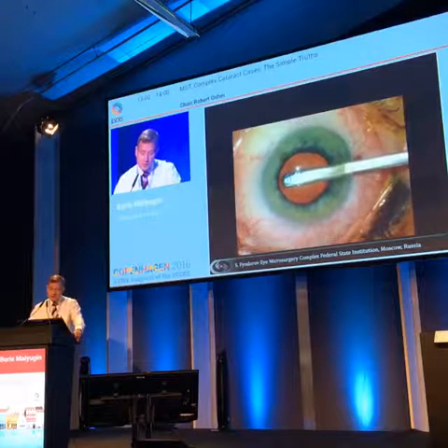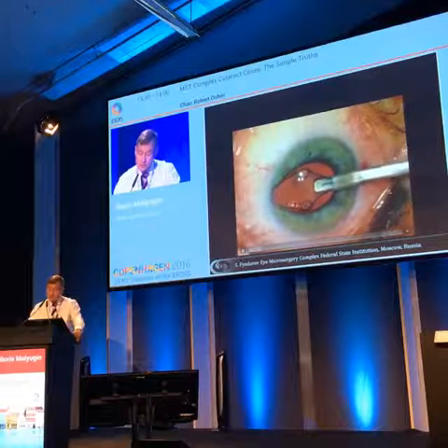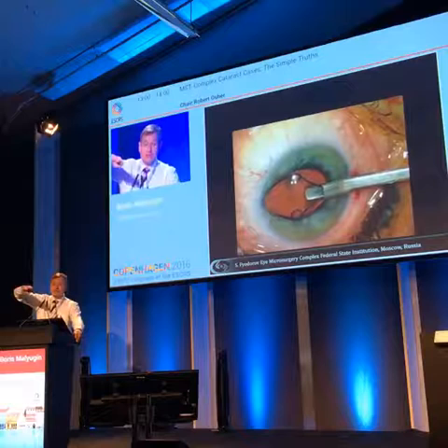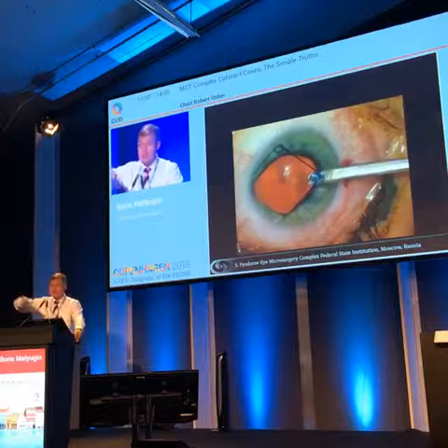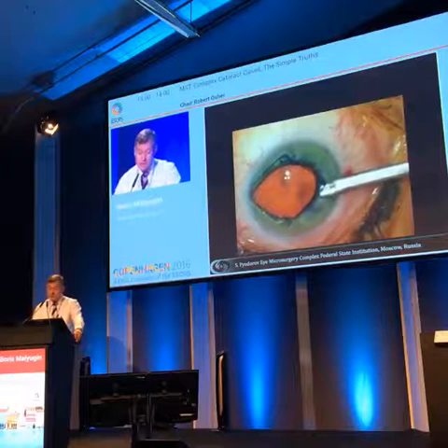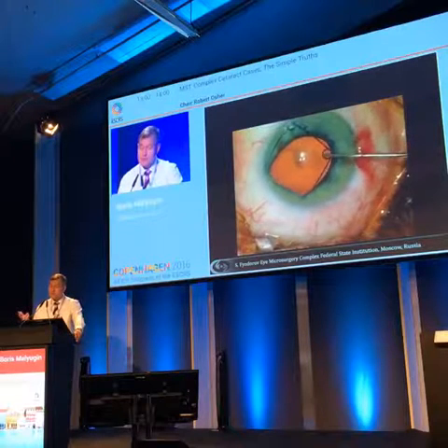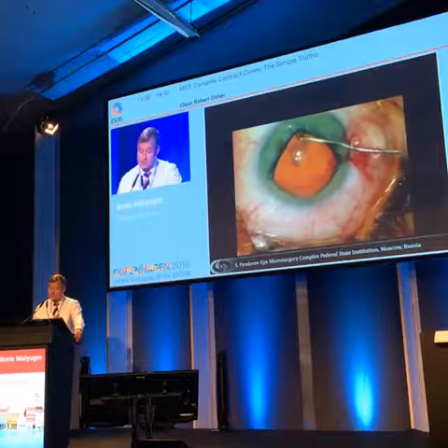I like to position the tip of the injector very close to the iris, because it helps me to control when I'm engaging the iris. And there is no shame in not being able to engage both lateral scrolls, because you can actually tilt the device a little bit, tilt the injector, in order to place it in a more proper position. This is a 7mm ring, because the second generation of the device also goes in two sizes. And I choose the 7mm ring because I was thinking about this for these cases to be managed.